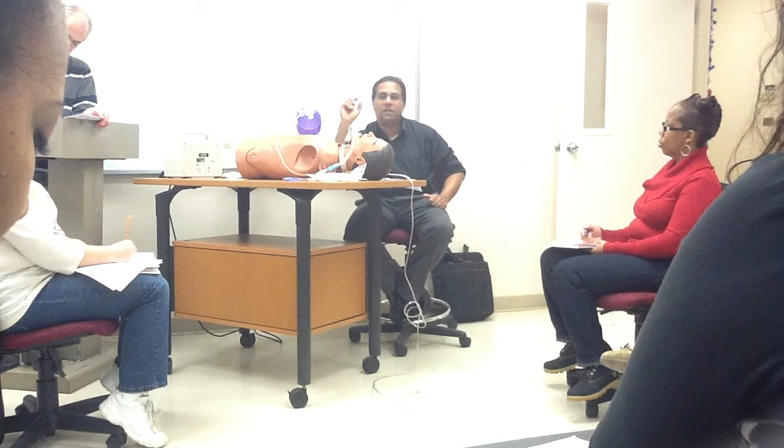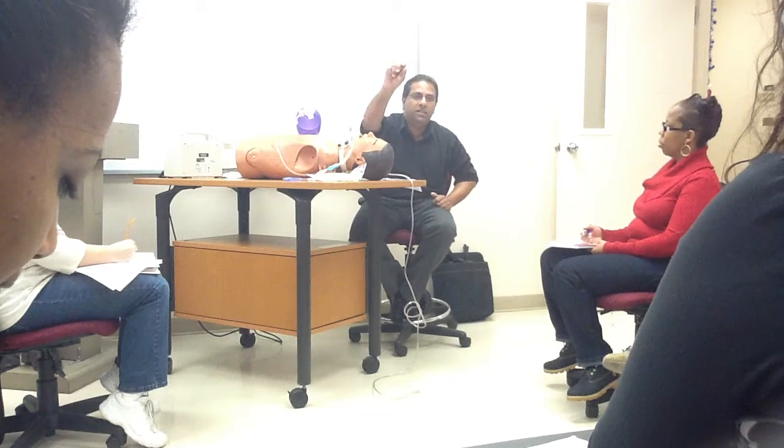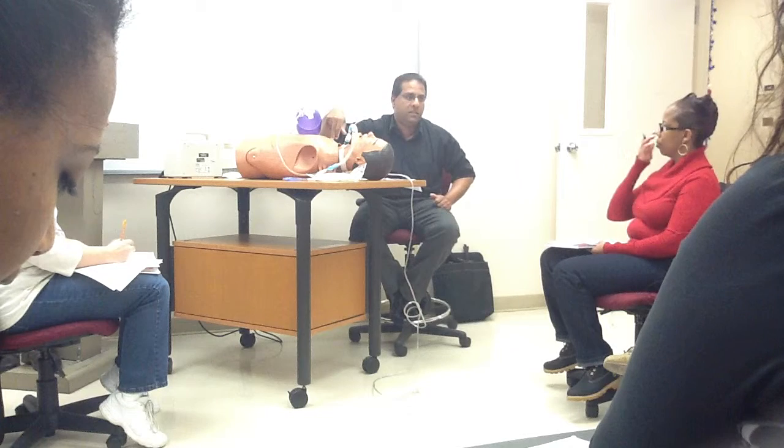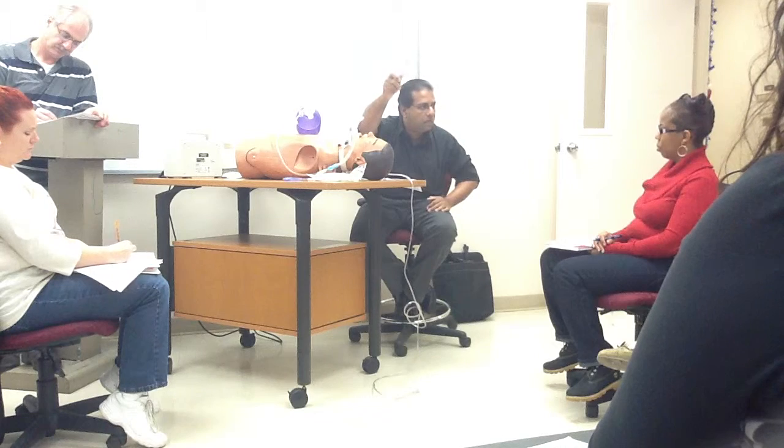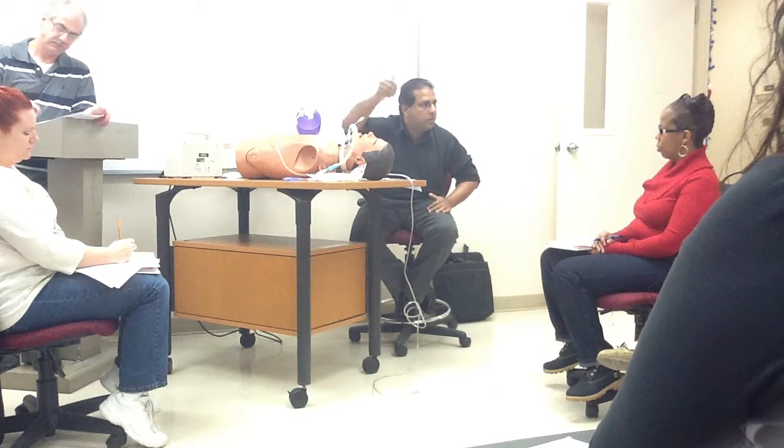So not all the patients are good enough. You can't just go over there and turn the FiO2 up to 100% and start suctioning the patient. It's not a good idea. But look at the patient. If their pulse ox is reading normal levels, and they're breathing normally, and you want to hyperoxygenate them, just go ahead and turn the dial on the aerosol bottle up to 100%. Even if they're reading 98, 99% pulse ox, you can still bump it up and give them a little bit more. If they are not taking nice deep breaths, yeah, you take them off and bag them.